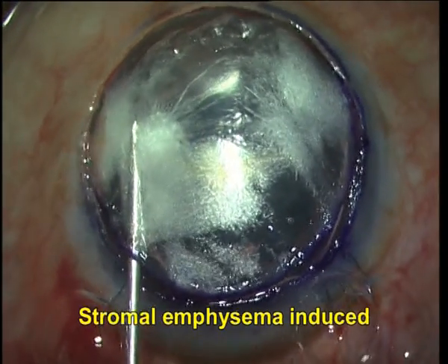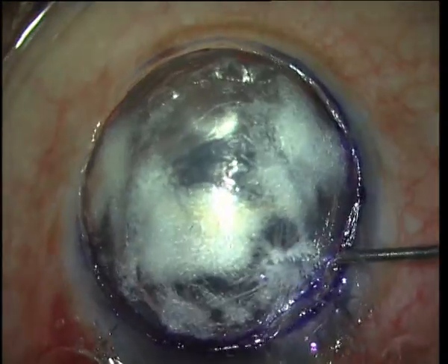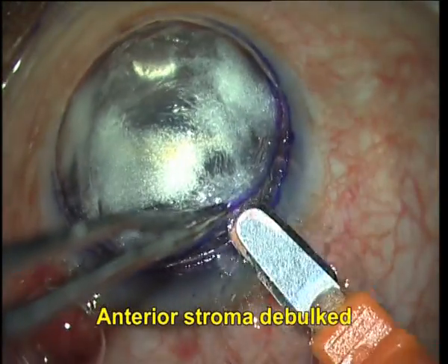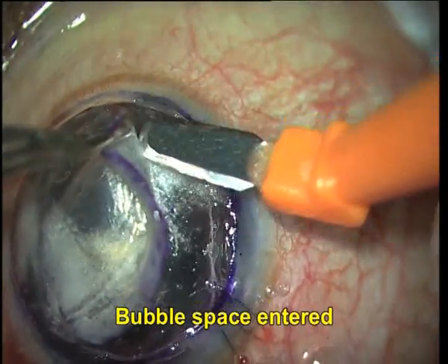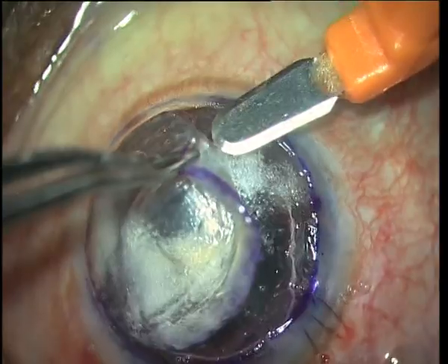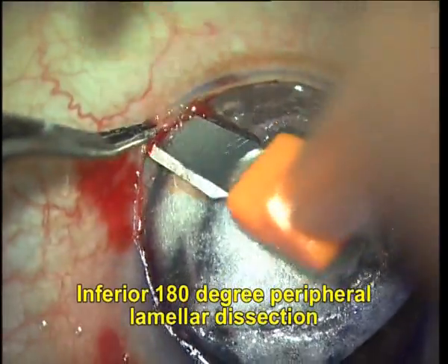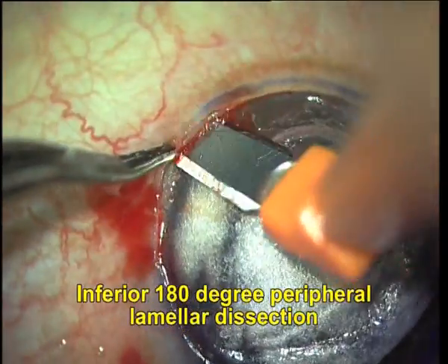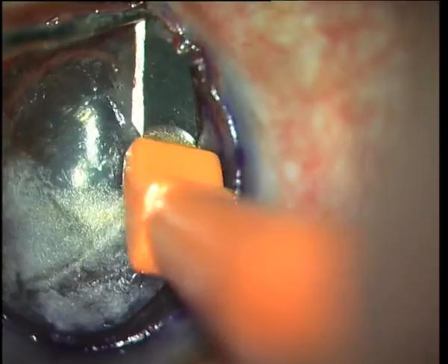What I do now is induce stromal emphysema to aid me in my dissection. Once I have done this, I take a bevel-up crescent blade and debulk the anterior stroma. As I go inferiorly, you can see that I have entered the bubble space there. I keep the flap back for the time being and now I concentrate on doing an inferior 180-degree peripheral lamella dissection to create a space for tucking in my lamellar graft.